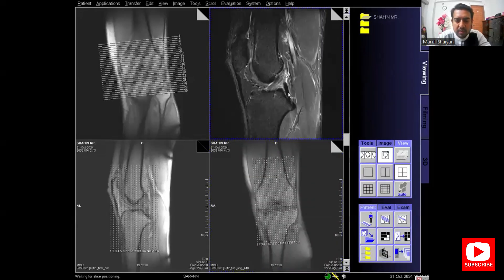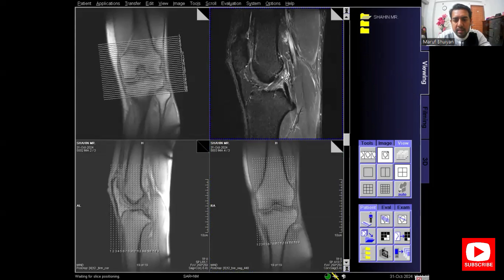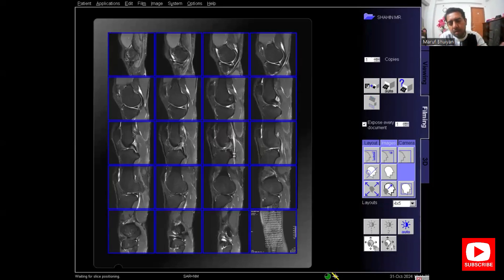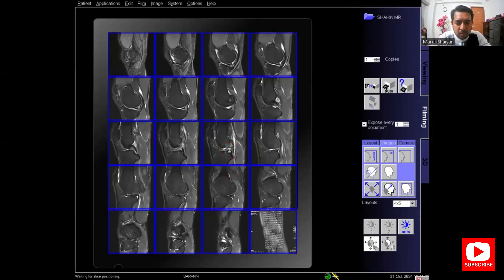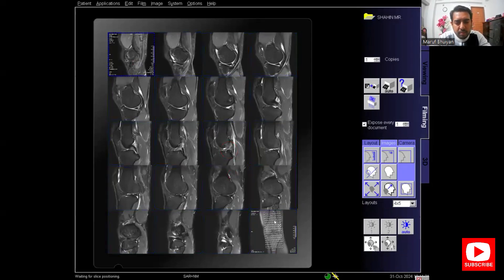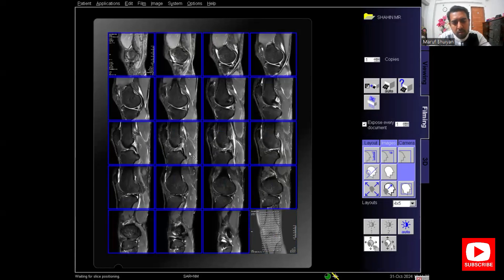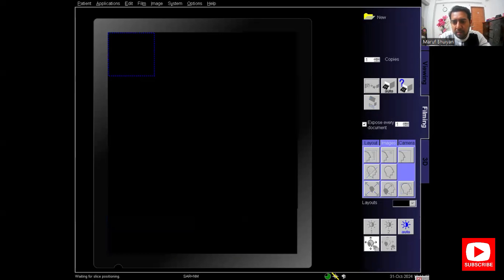Now the T2 STIR sagittal. This is the ACL — showing a slight signal change — and this is the PCL, looking normal. I select the series and send it to filming. In the film, I adjust the zoom panning and contrast for the T2 STIR sagittal. This is the fifth film — I will print it and the film is printed.